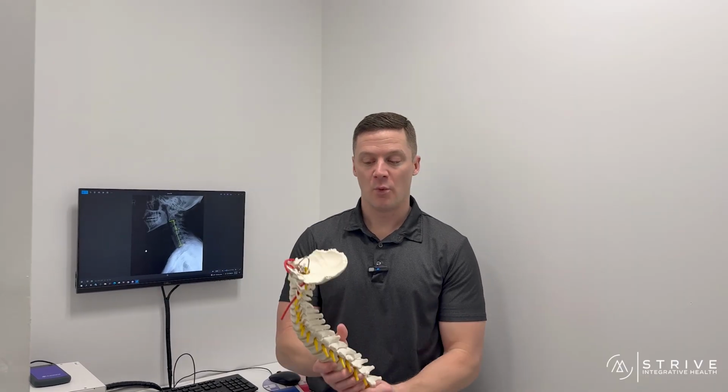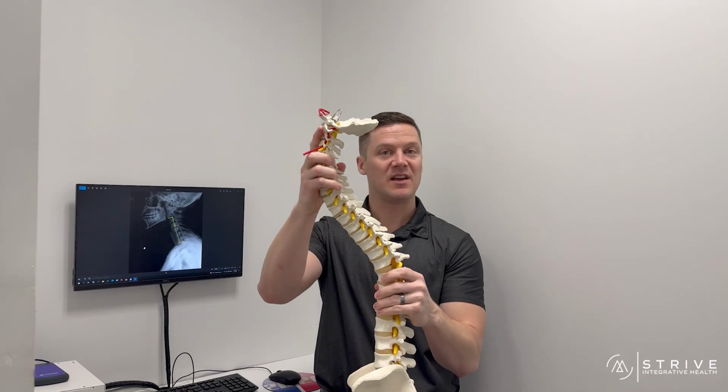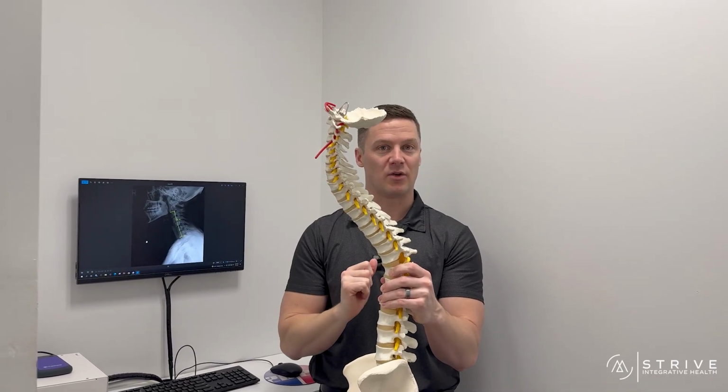Why do we take x-rays on all of our neck pain patients? This is extremely important because then we can see the cervical spine. What I mean by that is when we look at the spine, the base of the skull, we should see a nice curve in that spine, so it acts as a nice spring against gravity.